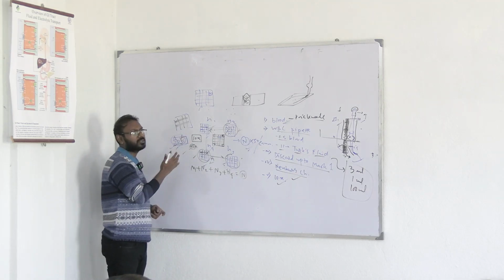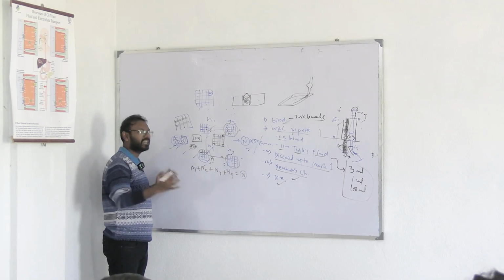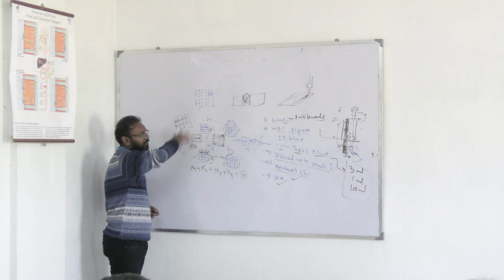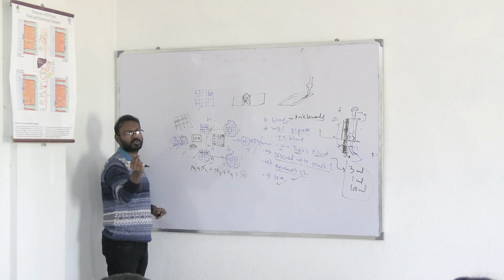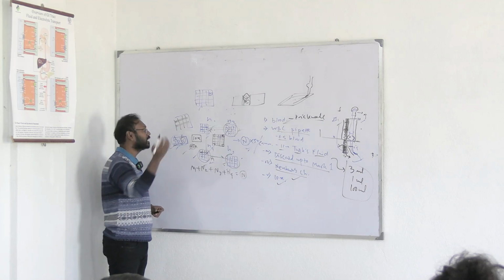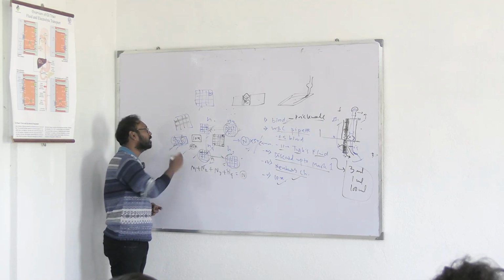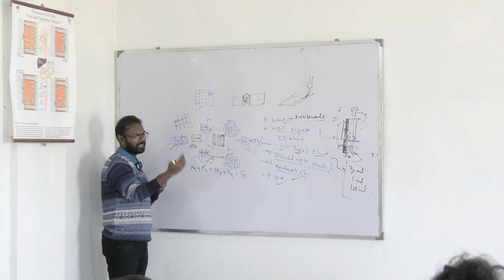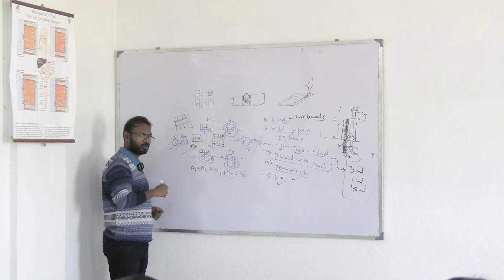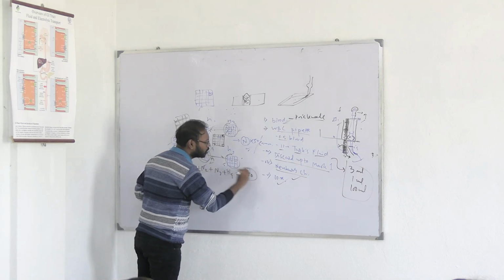How this calculation comes, when this is revised, your lab work will take very little time. When this is revised, I will come and tell you the equations again for those people who are not present, how to find the dilution factor. This 50n doesn't come suddenly one fine morning; a calculation with length and breadth gives it, and almost everyone knows, you calculated it yourselves last day. So 50n will be your WBC value.